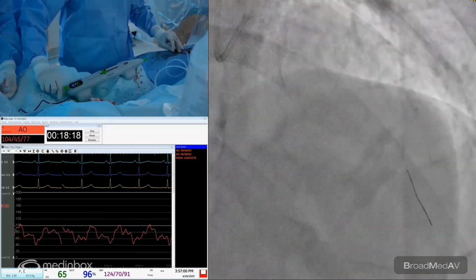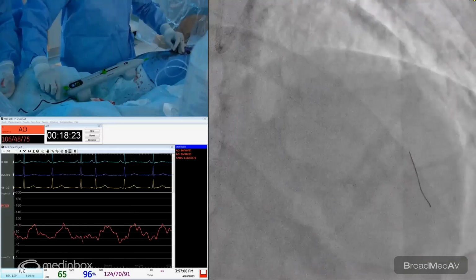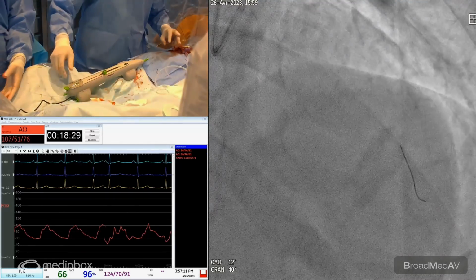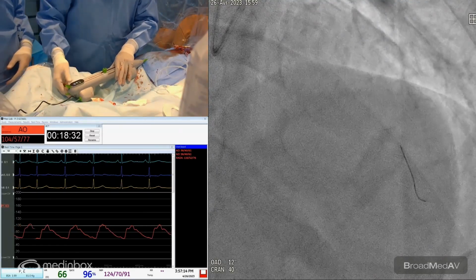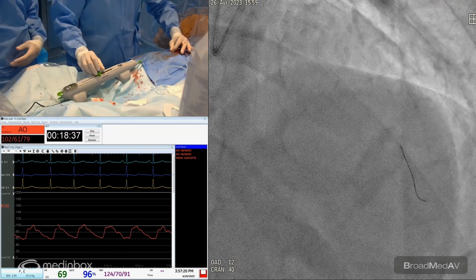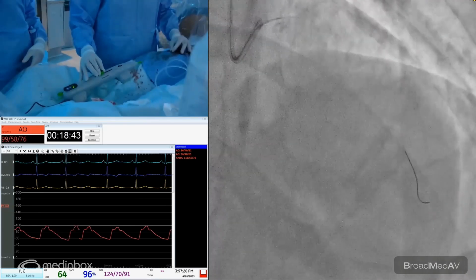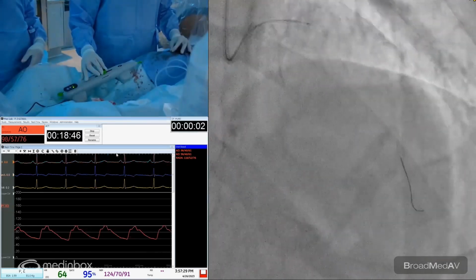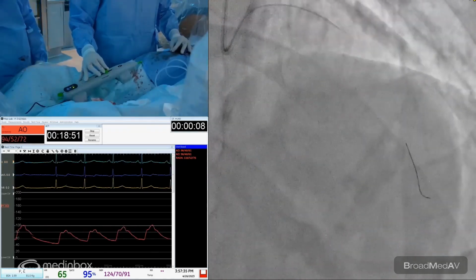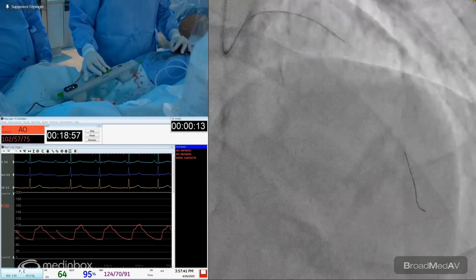And then you perform atherectomy. So I'm at the tip of the guiding now. I will stop the glide assist, put it back on. Then you lock the wire to perform the atherectomy. Make sure that everything is straight, turn it on, and here we go. The machine usually beeps after 20 seconds. So the technique is very different than using rotational atherectomy, where you need to do slow advancement. If you have resistance, you slow advancement to give it time to work the lesion.